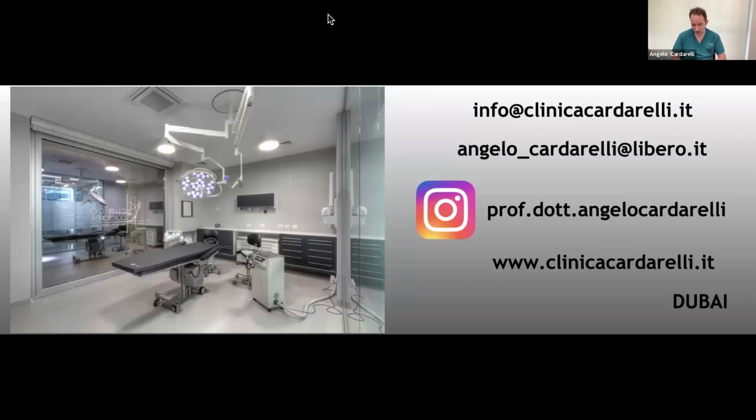For the impression, this is a right question. No, I don't use any kind of reference. Why? Because I can take the impression before the extraction, using the impression of the palatal side. So if I can scan the palatal side for the whole extension before the extraction, we can match the previous scan with the second scan, and then we can recognize the two impressions.